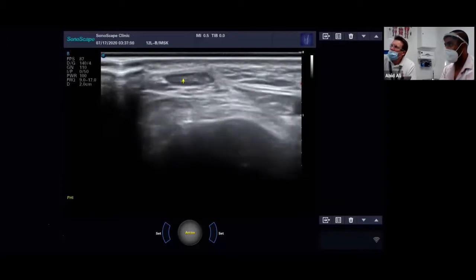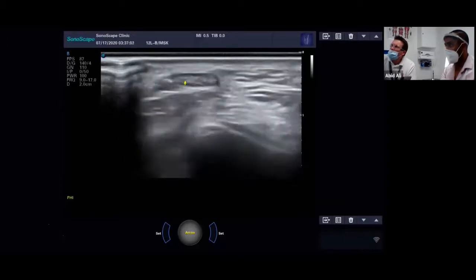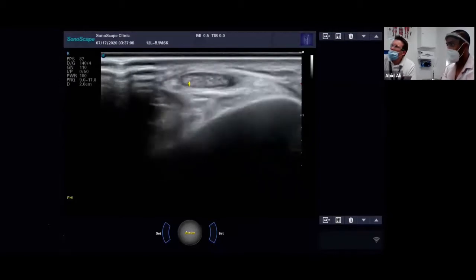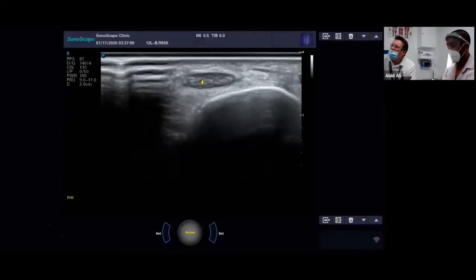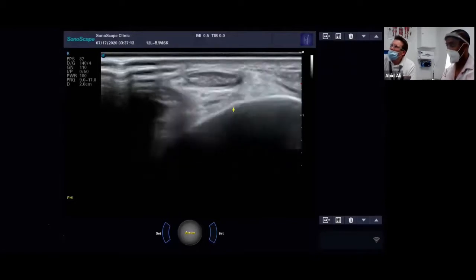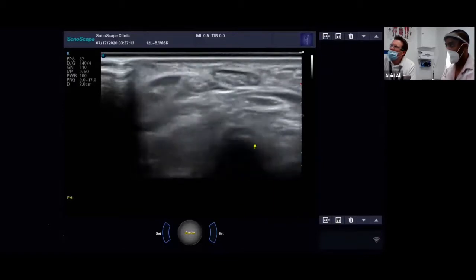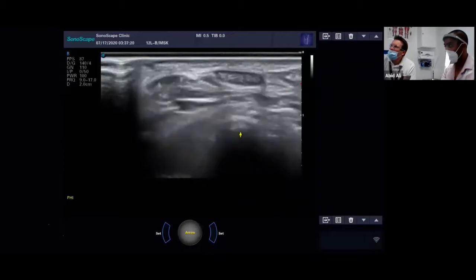So when we're looking at this, obviously we're not too worried about what's going on around it. All we want to know is what's going on with this tendon. Now you can just see the tibia at the bottom of the picture again. And you can see it falling away as we approach the ankle mortise. Now we're passing over the ankle mortise. Now we're just starting to see the talus in view underneath here.